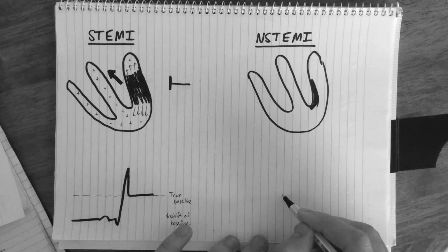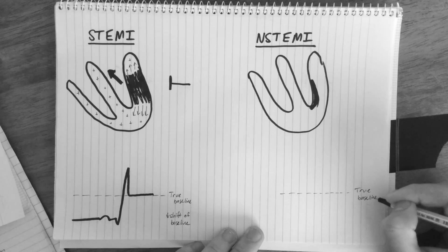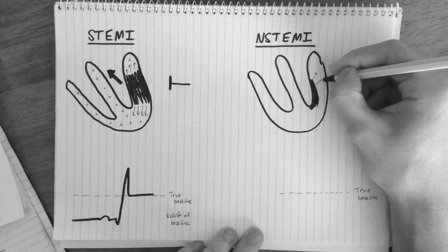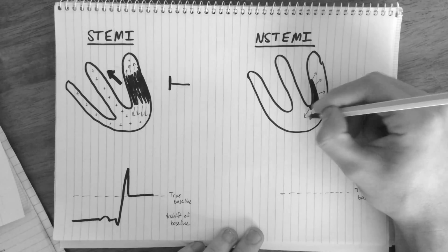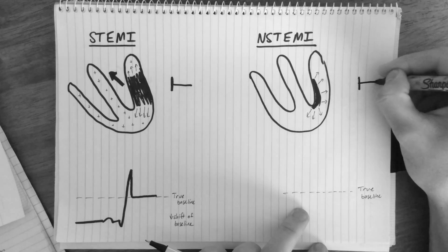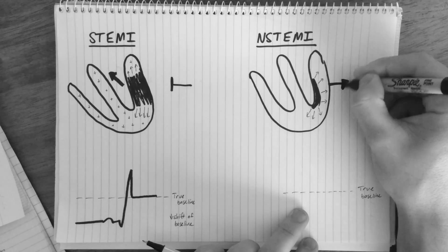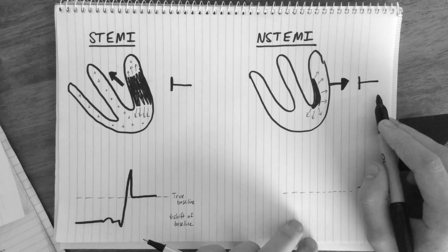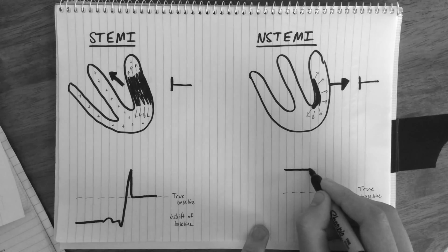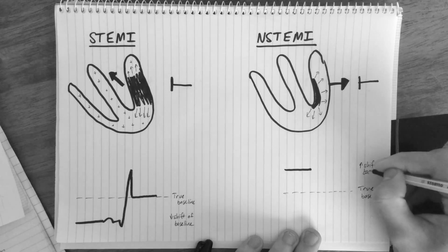So now to explain ST depression in NSTEMIs. So once again, it's to do with the baseline. Now here I'm drawing the true baseline. Because this is infarcted tissue here, it is depolarizing for the same reasons I have mentioned. And the depolarization travels in our direction away from the infarcted tissue. If we put our electrode in the same place, we can see that this basal level of depolarization is traveling towards the electrode. So we have a vector, a positive vector, traveling towards the electrode. This will result in positive deflection. So when we're recording our baseline, it is shifted upwards. So we have an upwards shift of baseline.